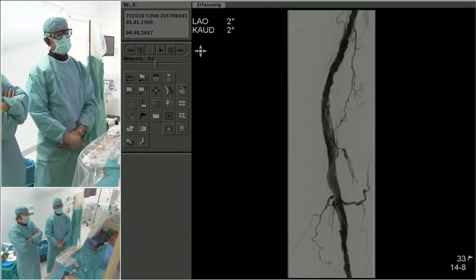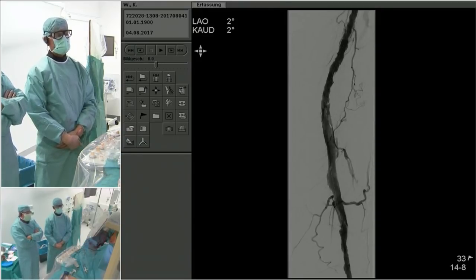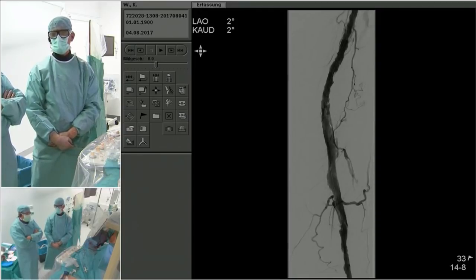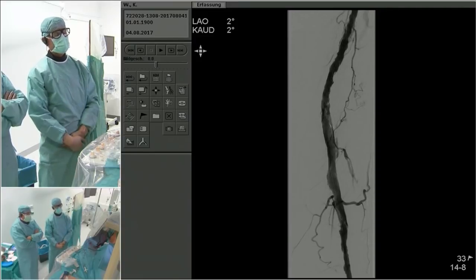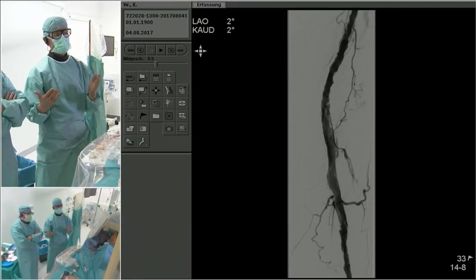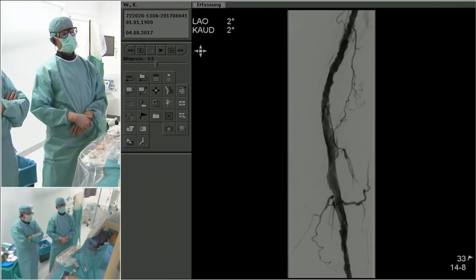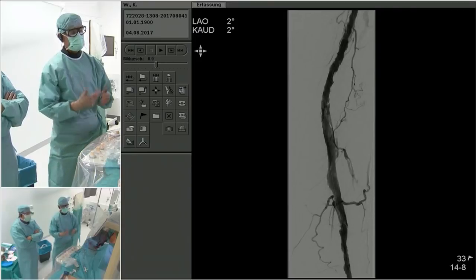Yeah, our experience with drug-coated balloons and really these calcified lesions is not good. So we followed our patients, and we have the impression that really in very calcified lesions it is not so helpful. We have quite some restenosis, and in some cases which we also retreated, it's rather recoil, or at least partially recoil, and not only hyperplasia. So clearly for us, with this calcium, it's some kind of Supera stent, that would be crack and pave or Supera only.